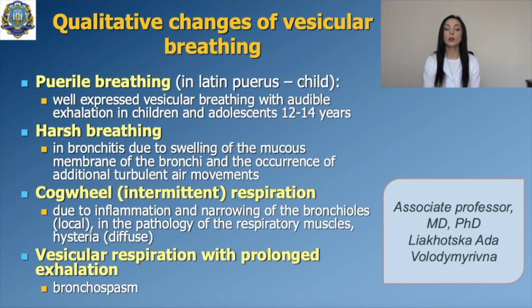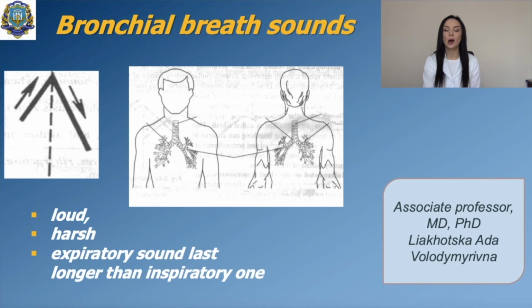Here you could hear bronchial breath sound, it's loud, harsh. Expiratory sound lasts longer than inspiratory one. Let's hear it.